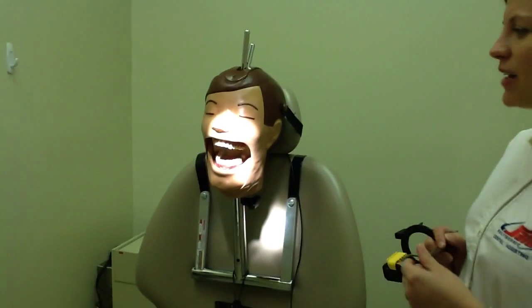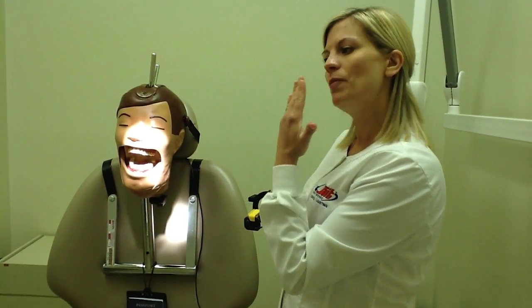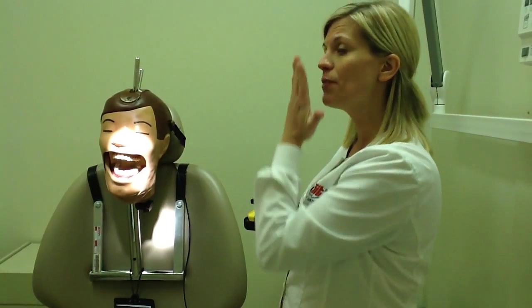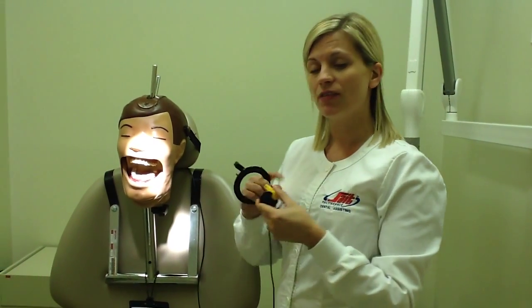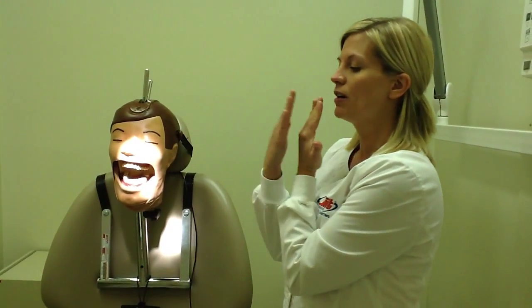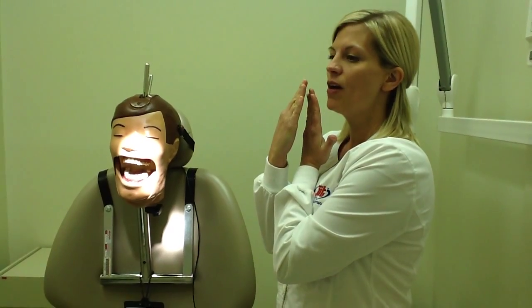Another example of that, or where you would alter that, is in the front. If you were taking a periapical of the anterior area, typically the long axis of our teeth will be more labial. They won't be straight up and down; typically there's a little bit of an angle outward. So if lining up an anterior receptor, you would position it parallel to the teeth. If not, you will have your receptor flat and your teeth would be positioned in this way, and that would create an elongation or an alteration.